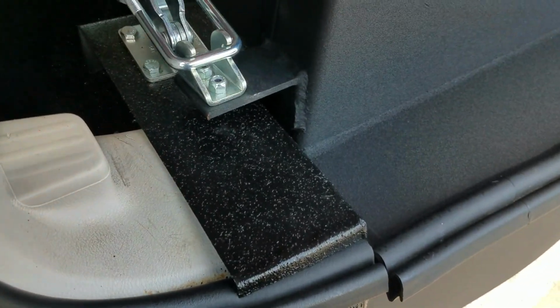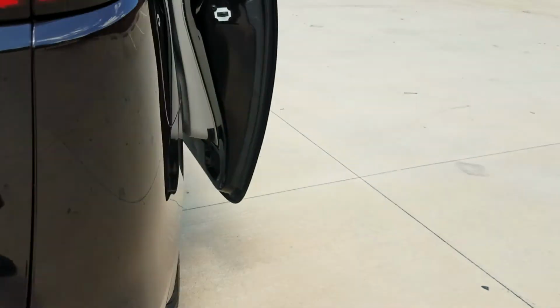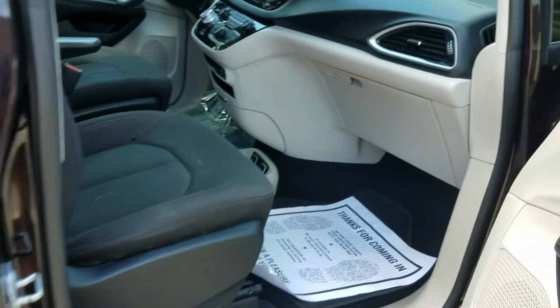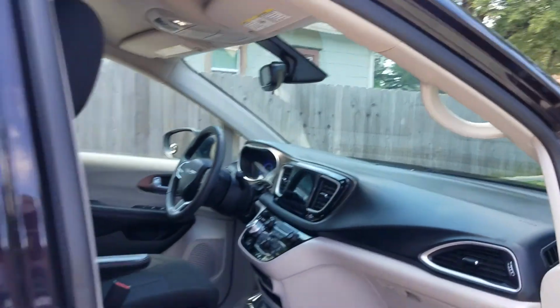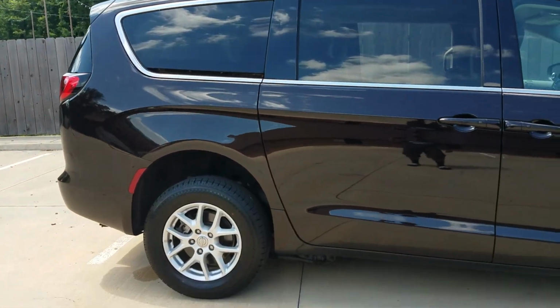These are nice because the electric ramps and doors are nice, but when they break, they are super costly to maintain. We can operate these sliding doors. You can shut them from inside the van. There's multiple points. If you're going to use this van for, say, a taxi, you can always switch them to off, and they become manual doors. So if you're going to be using them a lot, you don't want to tear up those power motors. That's an option as well.